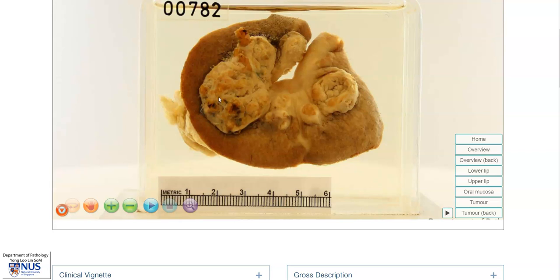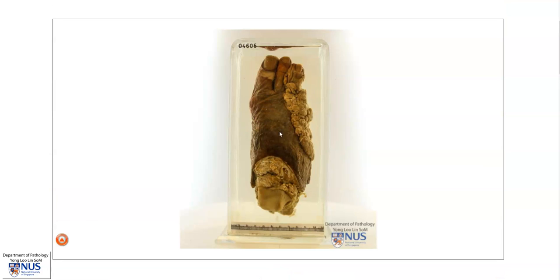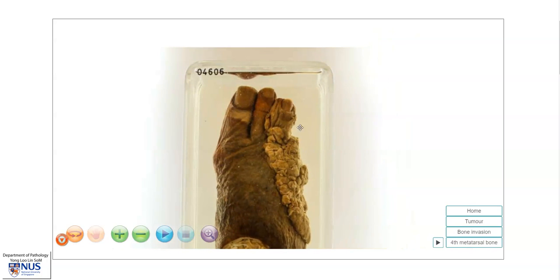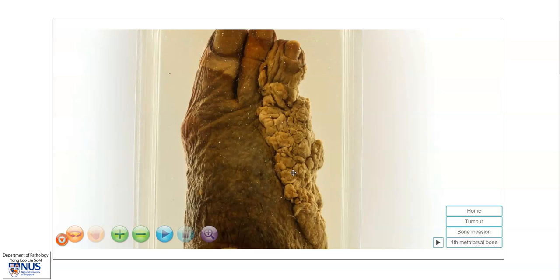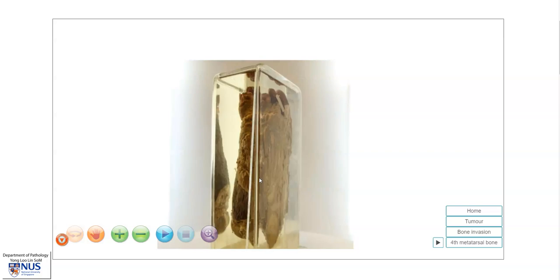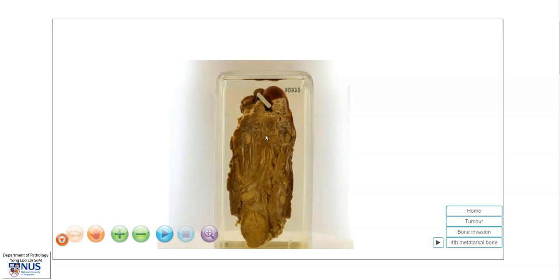Let's look at another example of squamous cell carcinoma. This time, the tumour is involving the right foot. This is a very destructive tumour that has destroyed the last two toes, and it is a fungating mass that is arising from the surface of the skin. We can see on the deep surface that it is eroding into the metatarsal bones.